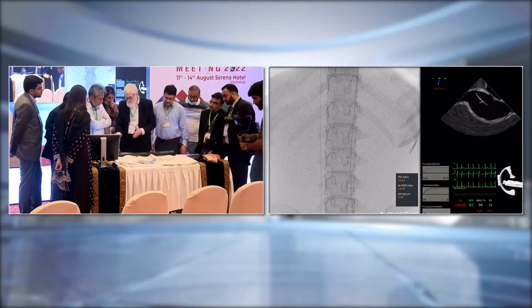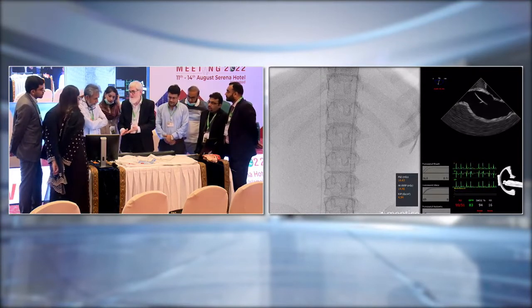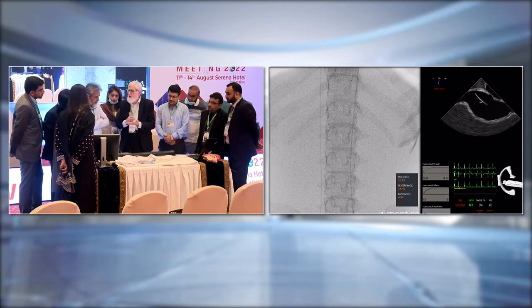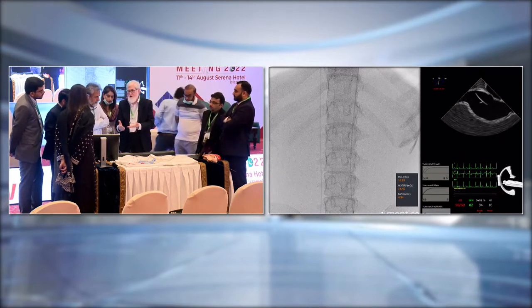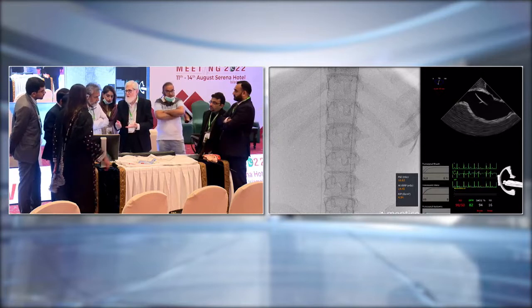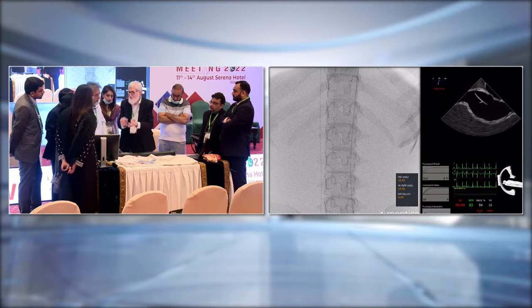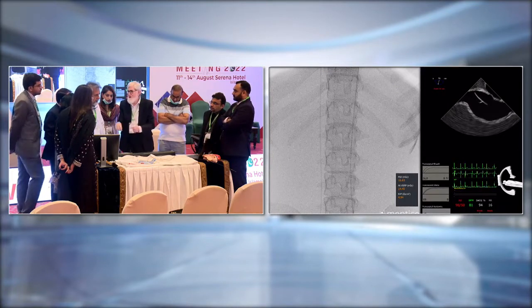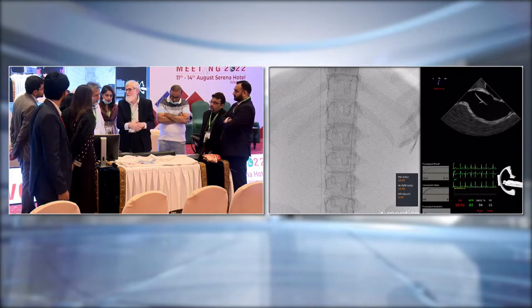Okay. Now what we do? We select a wire. What are the steps? We first make both the venous and the arterial puncture. Usually we save one sheet. We make a puncture, we put a wire, put the sheath, then we put the dilator, put a small J-tip wire, and then we remove that wire and put another wire, which is a 0.032 wire, and that we put into it.